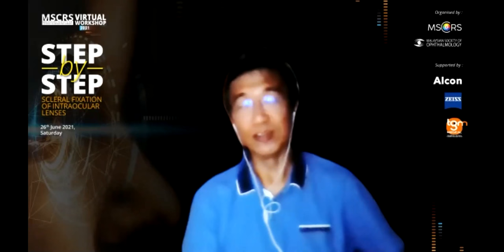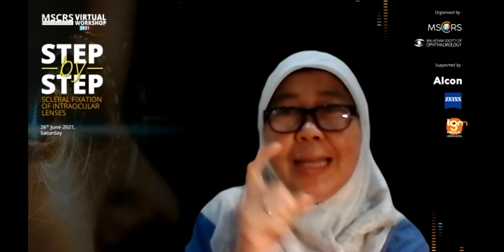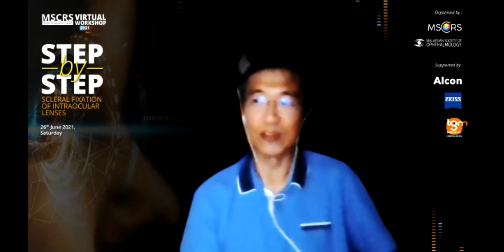I don't think so in that case. If our tunnel is short, then the haptic is just hanging like that. Is there a possibility? No, it's distorted, like the lens rotates. Instead of horizontal, it rotates. Correct, it's tilted.